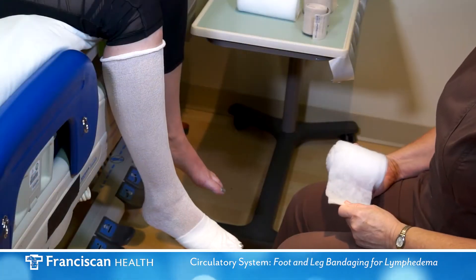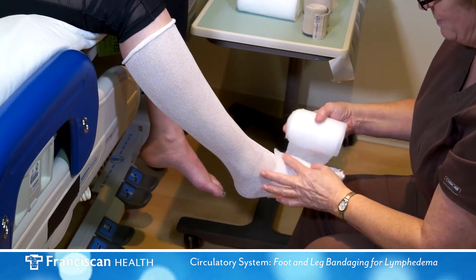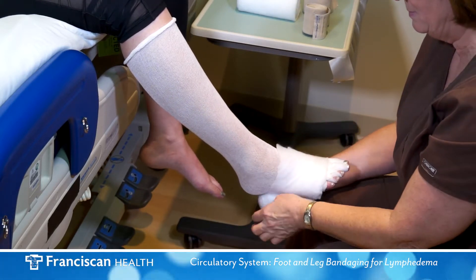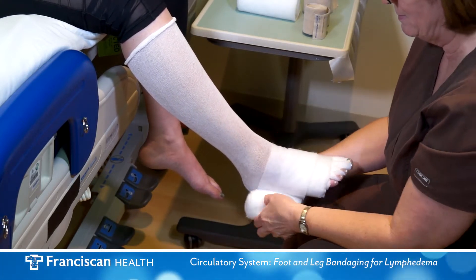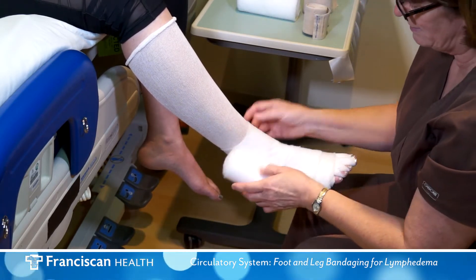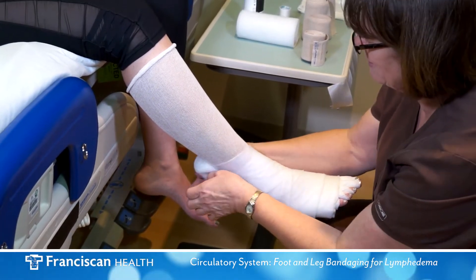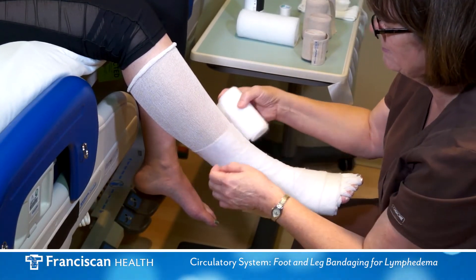Begin with the soft padding bandage at the base of the toes. Make spiral turns covering the foot and proceed toward the ankle. Overlap the bandage by 50%, continuing up and towards the knee. You may need to use a second padding bandage.